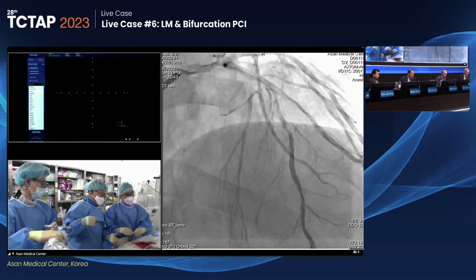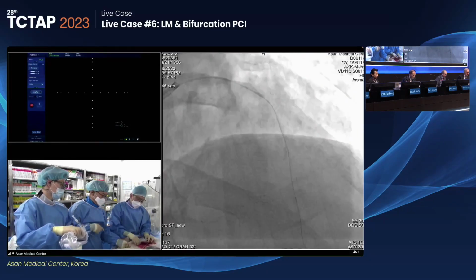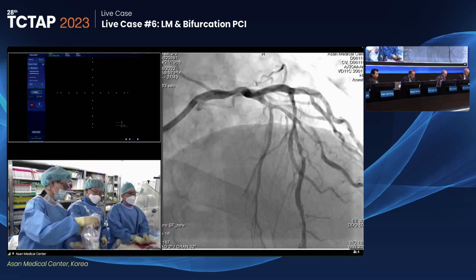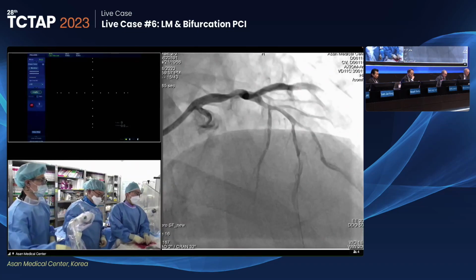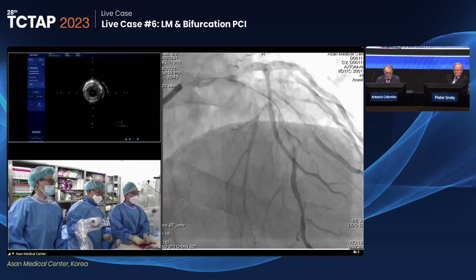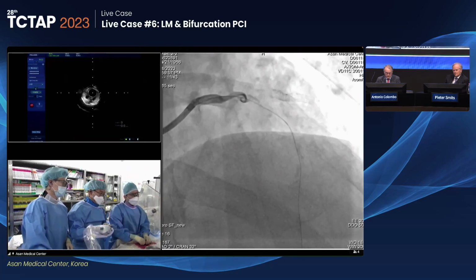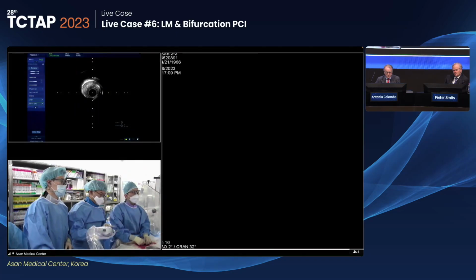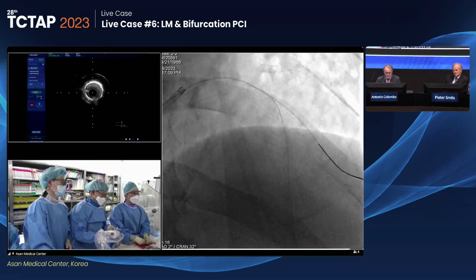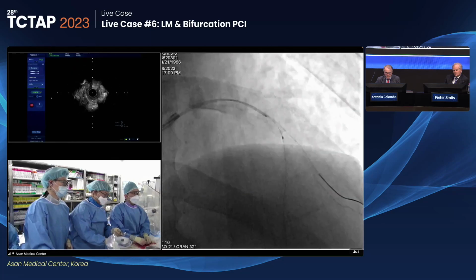And I think that in those cases, I hope not to cover the left main as Dr. Colombo recommended. And I will check the IVUS with the LAD. Actually, I applied 2.5 NC for tightest with the LAD region to open the lesion. And this is post 2.5 pre-dilation IVUS. IVUS is coming into the LAD.